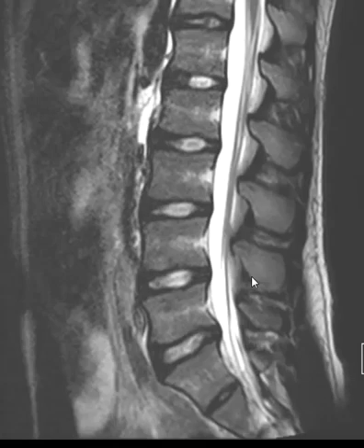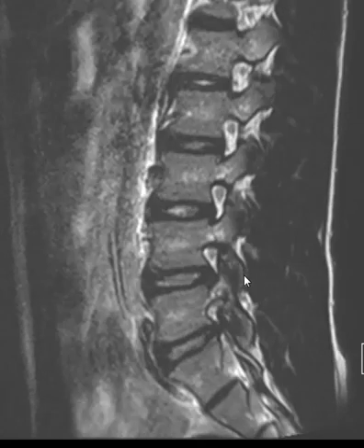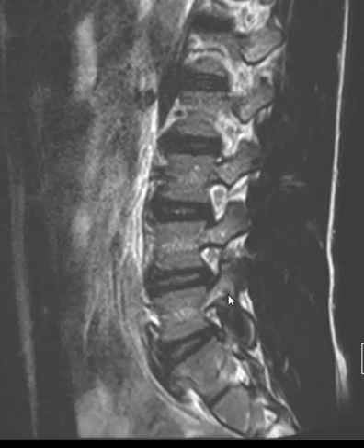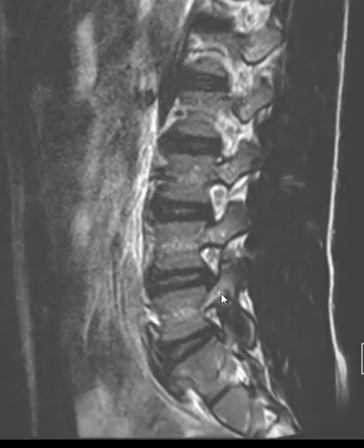There's a facet, here's a spinous process, and there's a facet on the other side. Now right beneath the facet, there's a bone that comes off called the pedicle. Right here is the pedicle of L5, and this is the L5 vertebral body. Right here there's a little bit of brightness — this is a very subtle finding on this patient — but there's a little vertical band of darkness. That's a little stress fracture, and the adjacent white area is surrounding fluid in the bone.